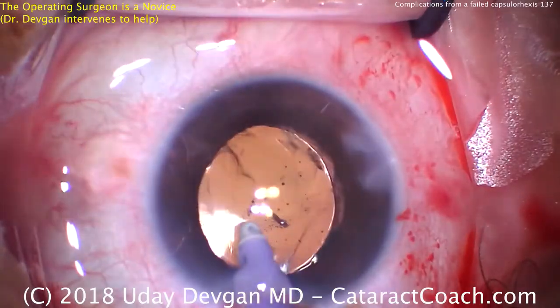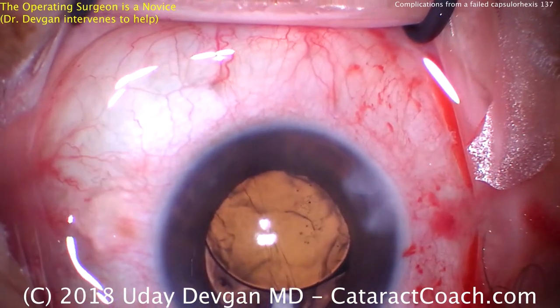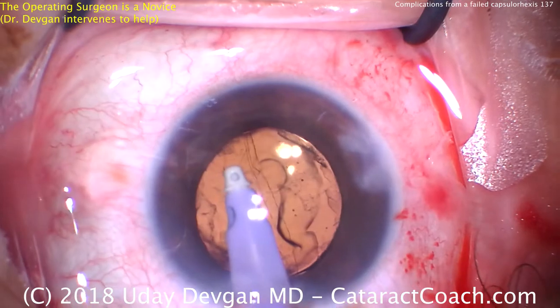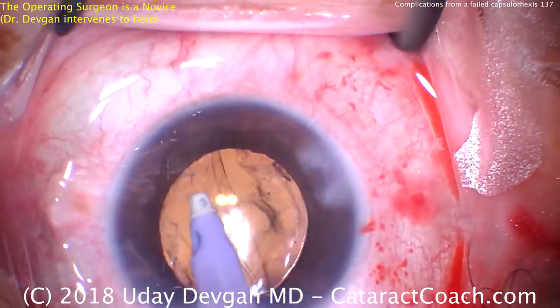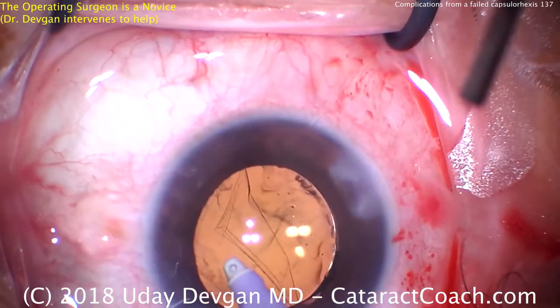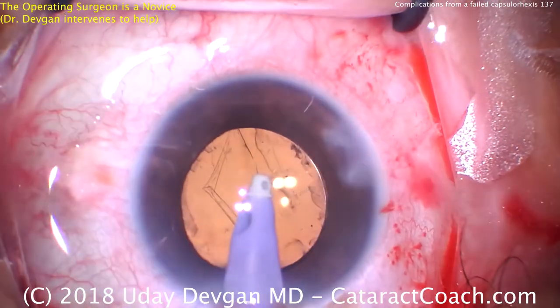Now we're going to be very careful in removing viscoelastic. The novice surgeon wants to go under the lens — I don't think this is a great idea — and when he does that, bam, he just grabbed the capsule and the capsule has completely ripped down the middle. The posterior capsule is now wide open, but luckily it's a narrow slit down the middle, so the rest of the viscoelastic is removed. We're very fortunate — we still have an anterior vitreous face that's intact, there is still no vitreous prolapse, and the lens is oriented horizontally, so this is a well-supported lens.